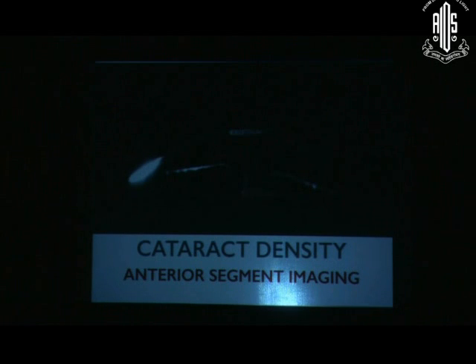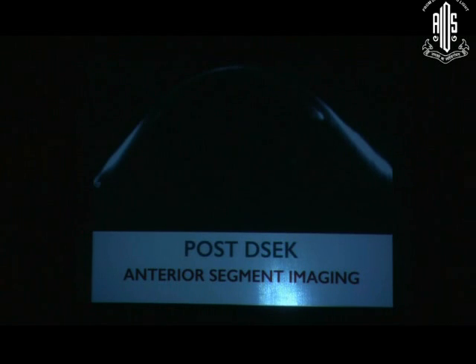Another aspect is the cataract density. Apart from the regular cataract screening, in post ICL cases, when we want to keep a watch on the crystalline lens developing cataract changes, we can do a cataract density. There is a densitometry in that, and it helps to know whether the cataract changes are happening at regular follow-up.